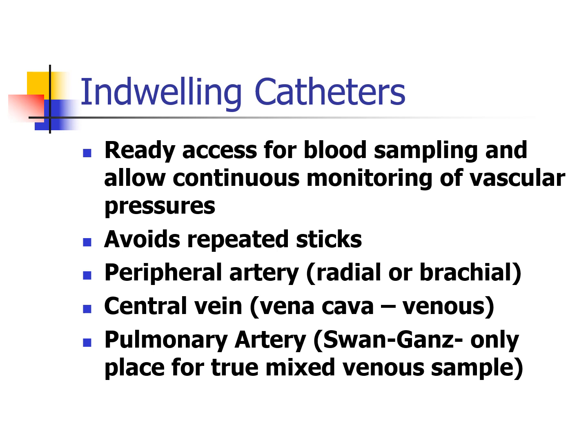This is usually only indicated to put an A-line in. The big thing here is if we have to do a lot of repeated sticks, like someone in severe ARDS on a ventilator, or someone with hemodynamic compromise. In other words, the blood pressure is super low or incredibly high, and we have to give them medicine to help their blood pressure in either way. That's what we're looking at there. So we avoid a lot of repeated sticks. It's great. Usually the radial and brachial sites are the most common place.